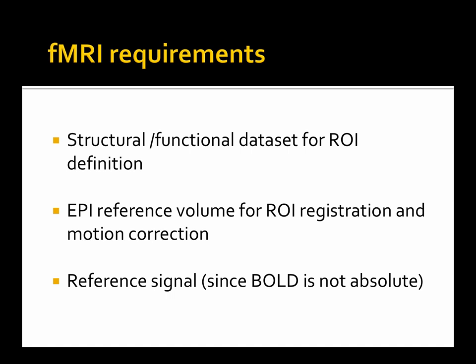could be either a localizer, just because we are using regions that were defined anatomically in the structural and then converted to the template, or we may have an actual task where we define regions of interest that we are then going to ask the subject to manipulate. So regardless of which one we choose, we need to select one of the EPIs.